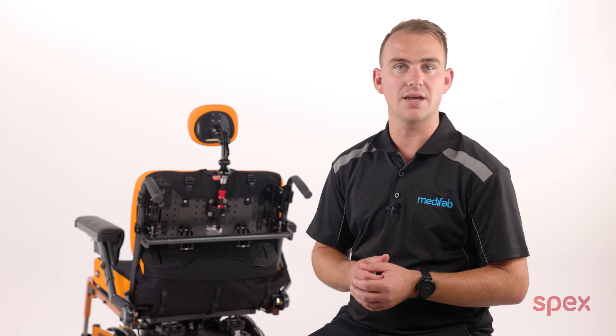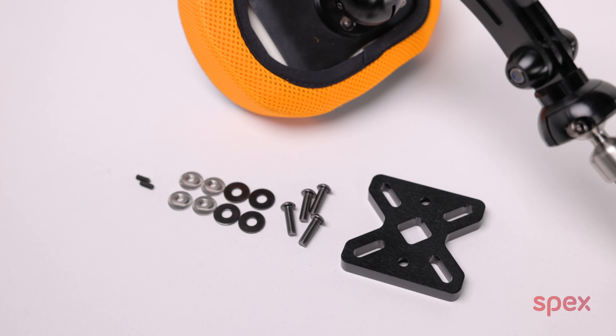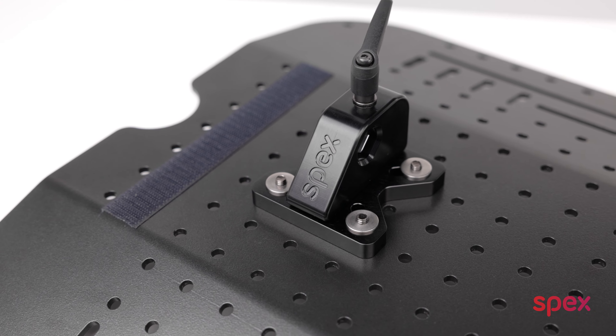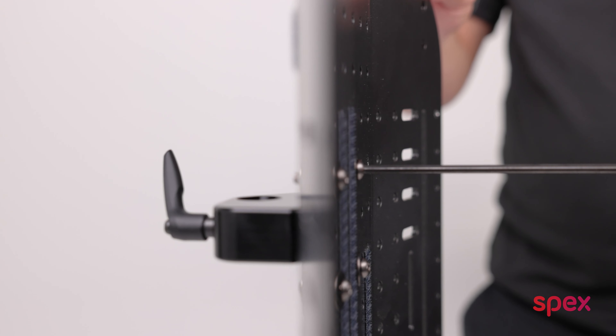So let's unpack the kit. It consists of this plate and some fixings for attaching it between the back support shell and the Stylo mount. There are also some grub screws included. The plate has been carefully designed to enable easy mounting to the Specs back support shells, fixing from the inside of the shell with these four bolts.